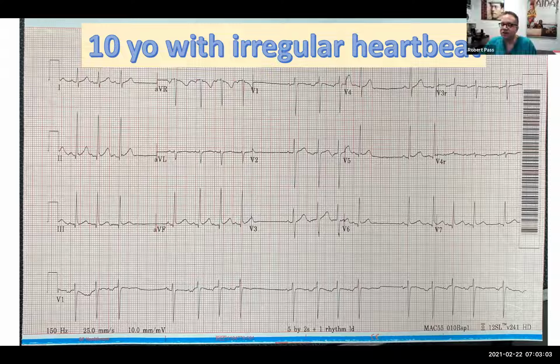Let's say that again. It seems to be what? The Wenckebach, like the pause after the dropped beat seems to be longer than I'm used to seeing. Are you sure that it's all sinus?